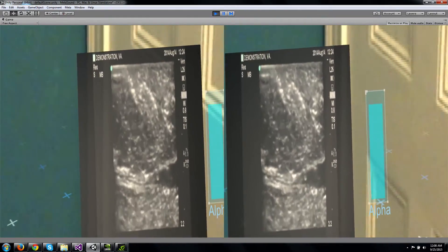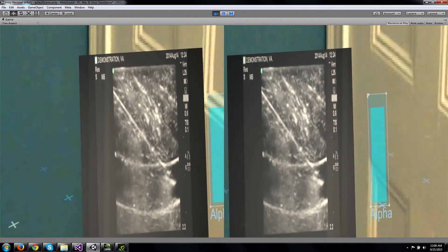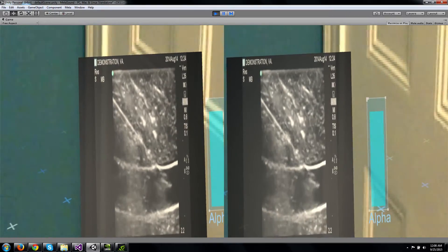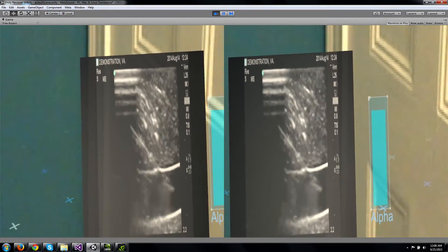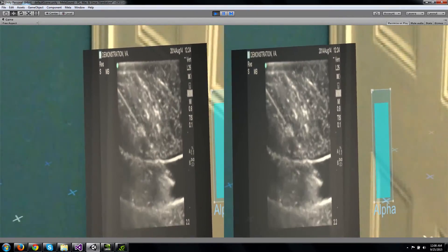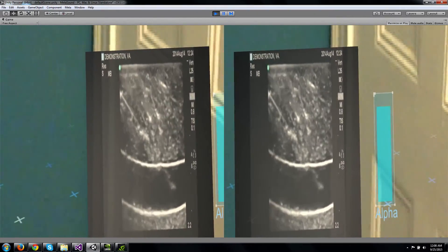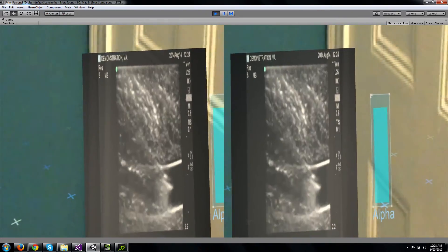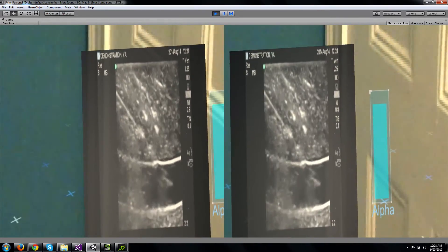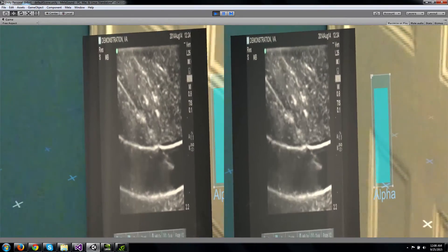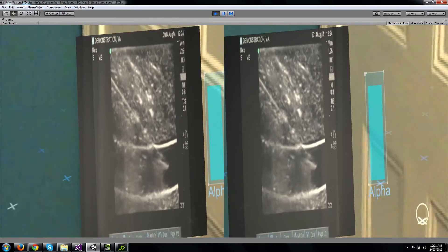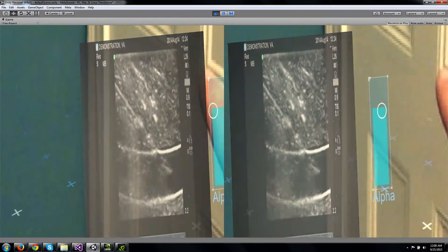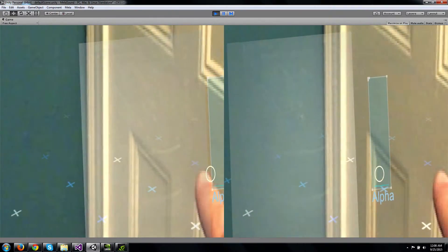Hello, this is Jeff Bale. I've been working with the Meta Workshop here in Boston, and in just a day's work, I've put together a little bit of an ultrasound demonstration, and in this application, I can reach out and control the alpha transparency of my ultrasound image here.